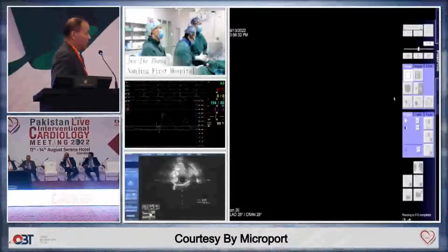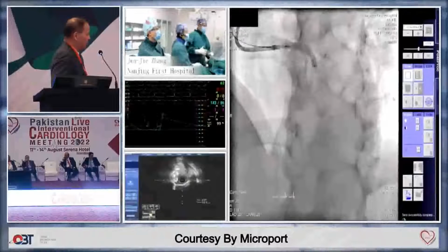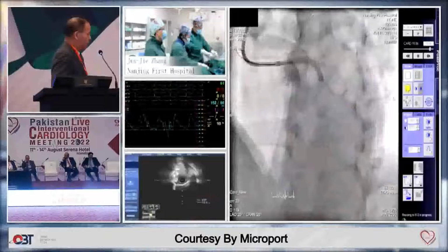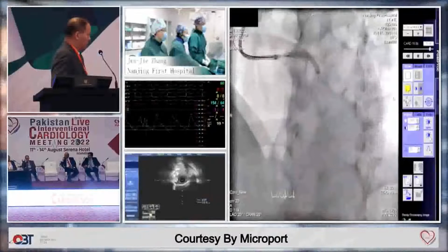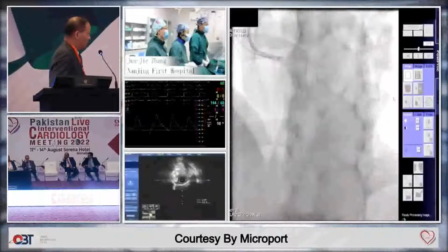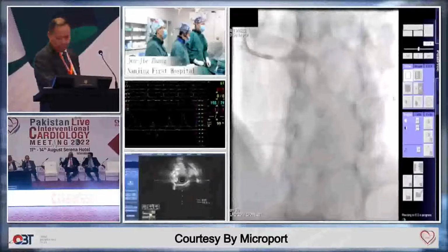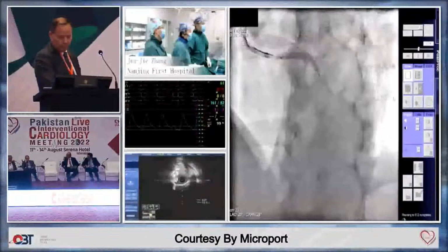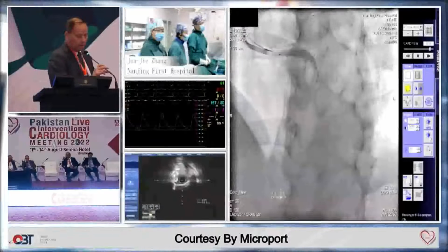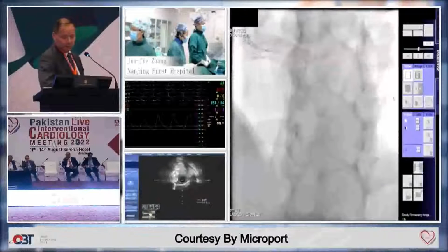And also, for some junior populations, it will be very tough. But to achieve the maximum 1 millimeter protrusion, multiple injections are needed, particularly in this case. The left main is always at an angle, so you have some protrusion coming. If you put the marker wire there, you see where the ostium is. You hang a wire over there, something like that. You can put a marker wire.